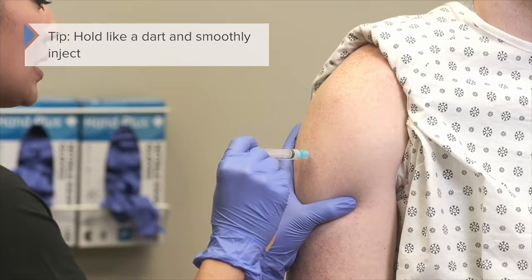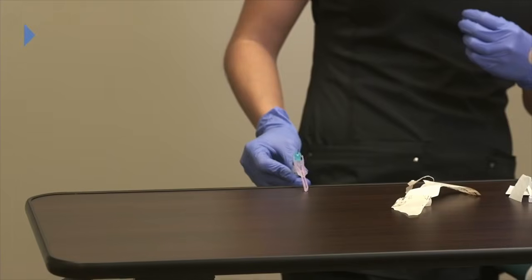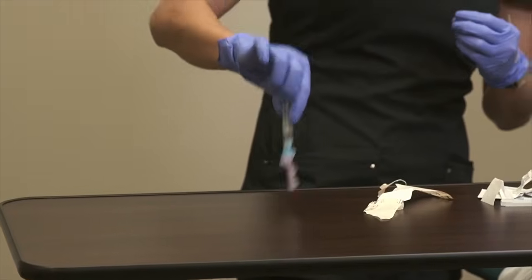Once the medication's in, I can pull out the needle, let the patient's arm relax, and I like to use the bedside table to get the needle away from me and my patient. I put this here and just let this click. That's the click you want to hear. Now, this is nice and covered and safe.